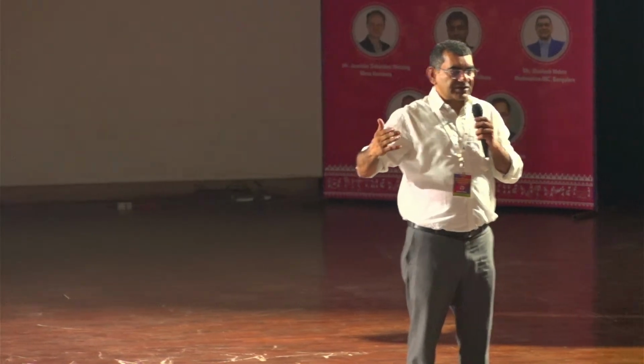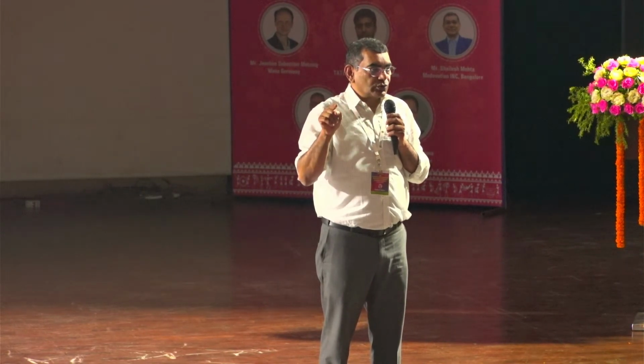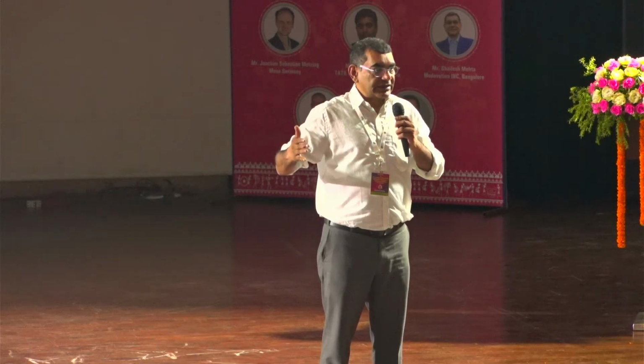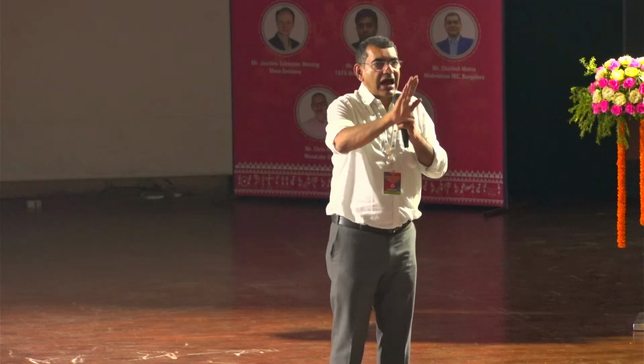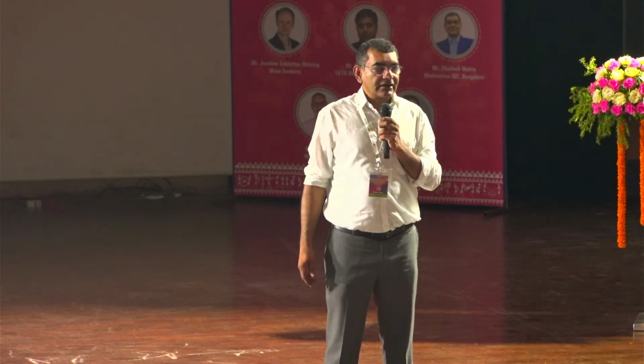You think about the reprocessing cost first. It works on STU. I don't want to go too deep, it's a deep subject. Please do some homework on STU, size per weight costing. If you come to know the costing of each pack, half of your items won't be reprocessed. I see oxygen masks, nebulization masks, cautery pencils being reused. Do you use cautery pencils or not? What is the cost of a cautery pencil?